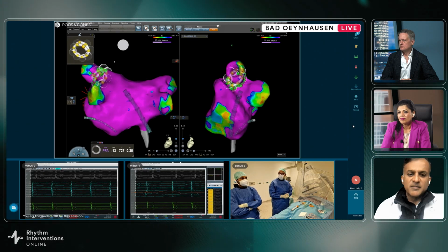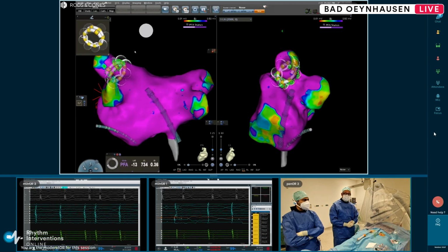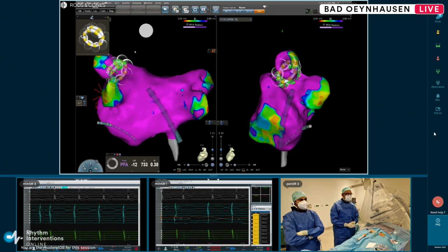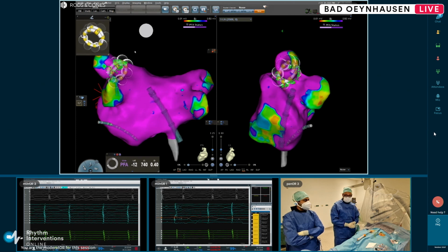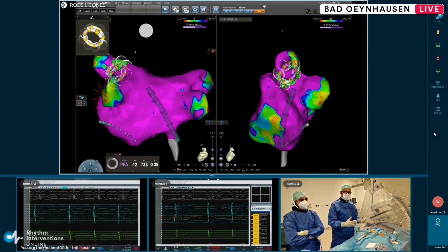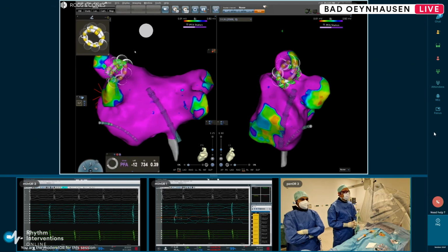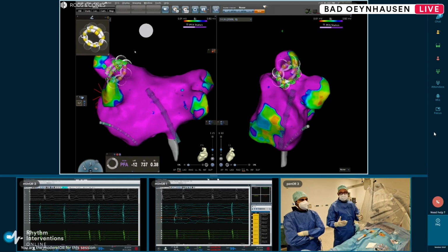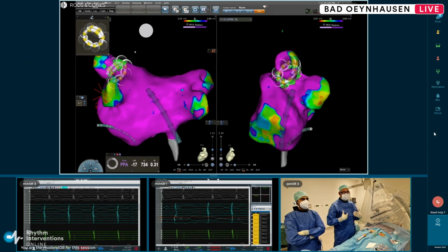Yeah, at the very beginning, we give the patient some Dormicum, some midazolam, together with a bolus injection of propofol, which is weight adjusted. And after this bolus injection, we keep going with an infusion of propofol during the procedure, and you will see this works quite good. In addition, prior to ablation, we give the patient some fentanyl to avoid any pain. We don't know if it helps or not. And this is more or less what we're doing. Why we discuss this is exactly the time we have now from the fentanyl injection and also the giving of the atropine. You will also see this in our experience.